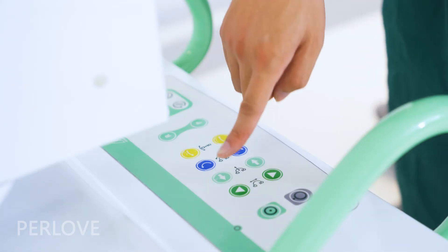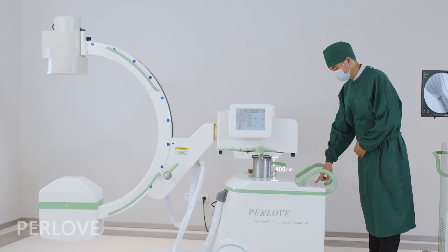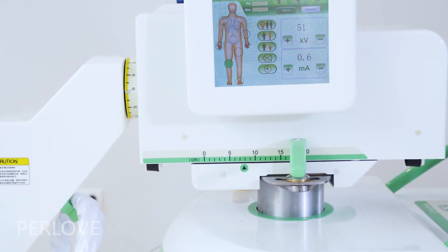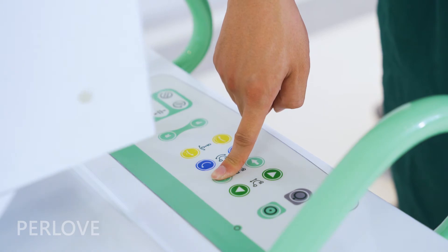This control panel makes the C-Arm electrically lift up and down 400mm, and electrically move backward and forward 200mm.